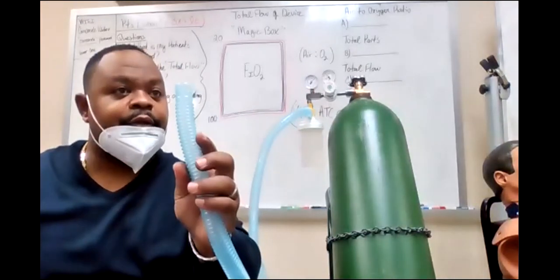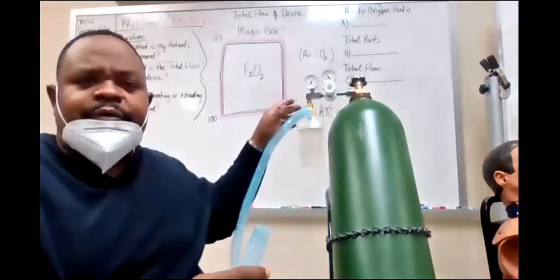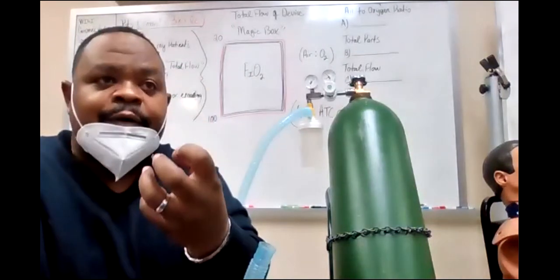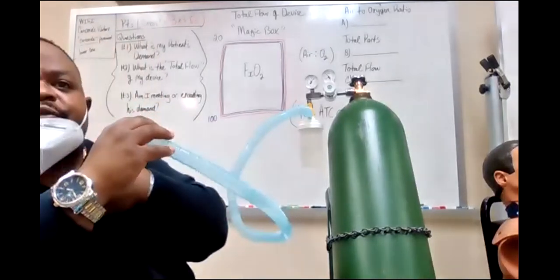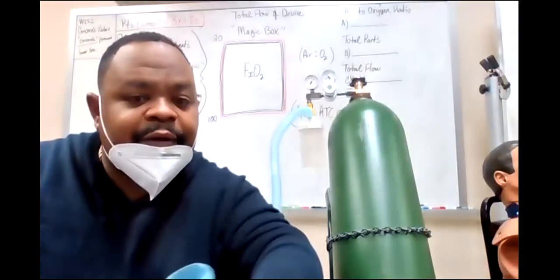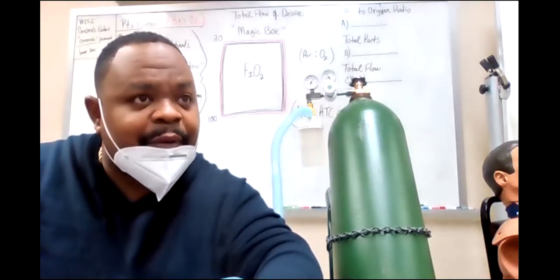And this is the other end here, okay? Now, as this water and aerosol is going through there, eventually it's gonna start collecting, right? Called rain out. And so what's gonna happen? If that rains out, it's gonna go down my tray, right? And drown me. So in that case, now you might can see, can you see the mist coming out of there? See that? Okay, see how fast it's coming out?